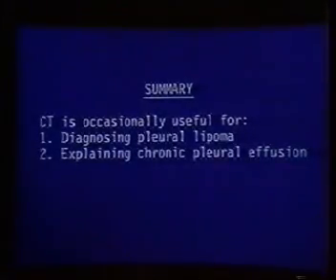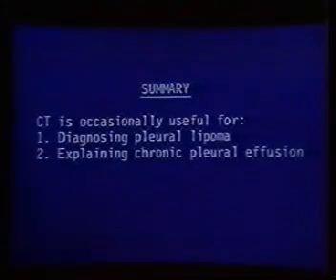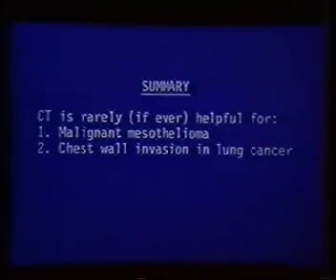And once in a while, when you have chronic pleural effusion, if you can demonstrate nodular implants, as I've shown you, or subpleural cavitary lung disease that might indicate the presence of tuberculosis that has resisted diagnosis to date, you may be able to have your clinicians press on, make more effort to come up with a final diagnosis. But in my own experience, I think CT is rarely, if ever, helpful or indicated in patients with either malignant mesothelioma or peripheral lung cancers where you're trying to determine chest wall invasion.